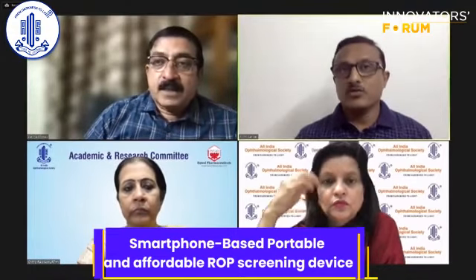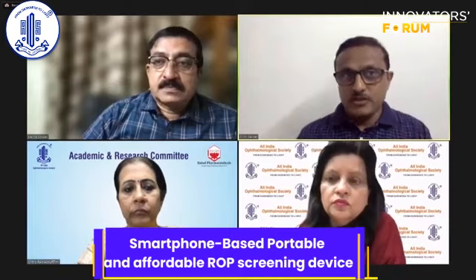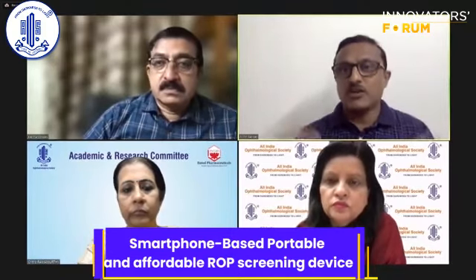Right. Good question. We've researched this because we get a lot of queries when we present this. We've sold about 120 devices so far all over India, and a few also outside India. Roughly, we've guessed that it takes between 50 to 70 screenings per person to get real good images.